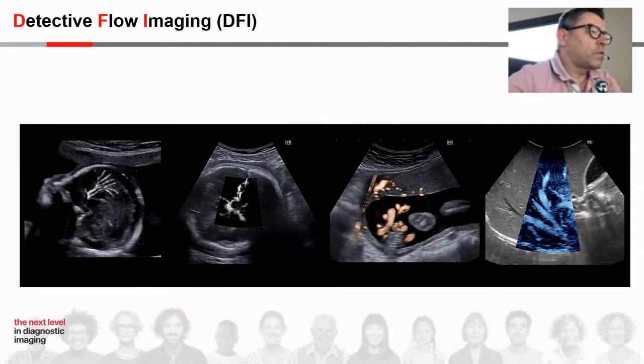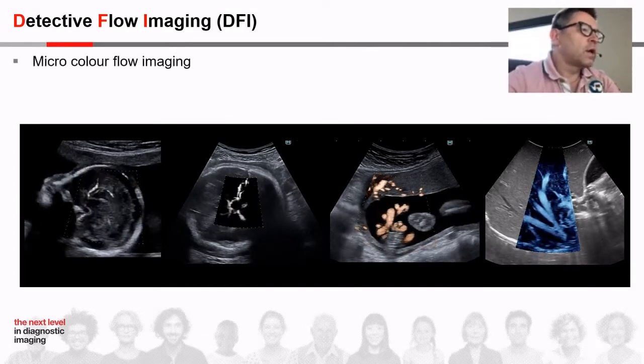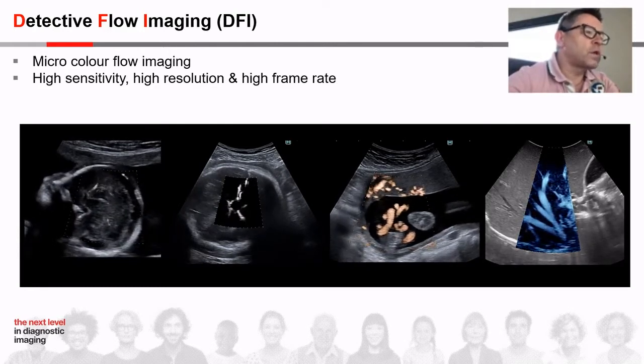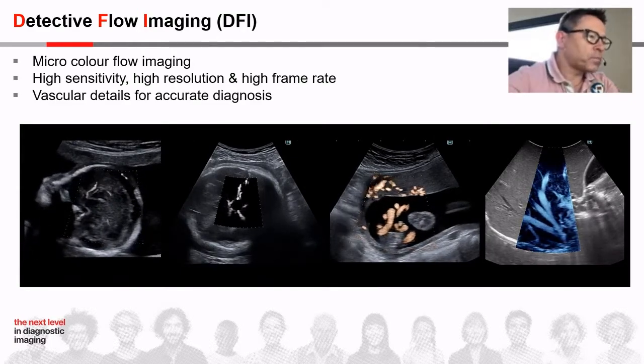Good morning, everybody. I will introduce you DFI. DFI is a micro color flow imaging that both provide high sensitivity and high resolution with high frame rate to depict vascular details and obtain easily an accurate diagnosis.